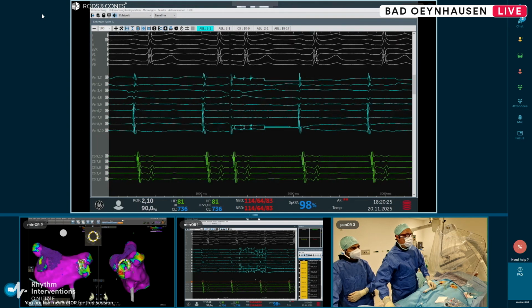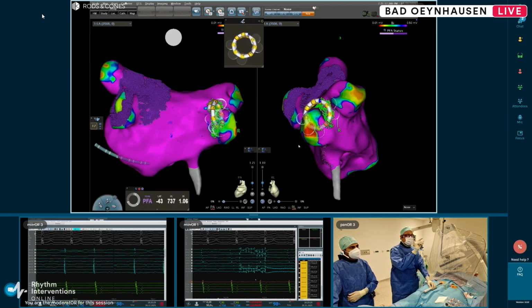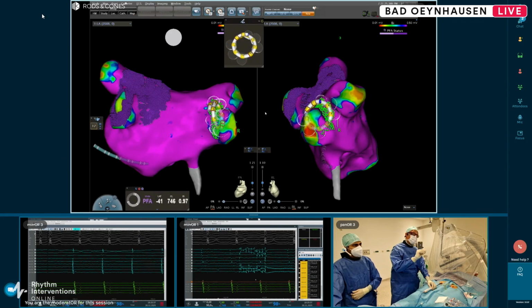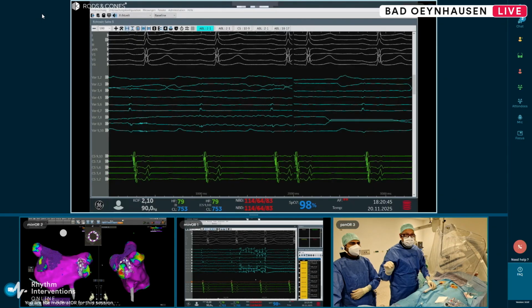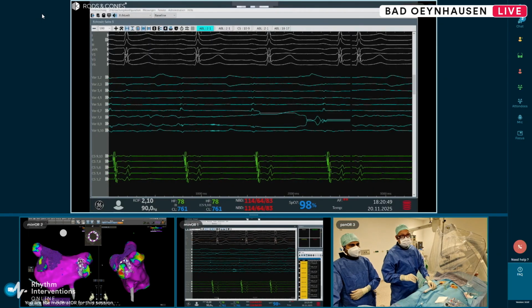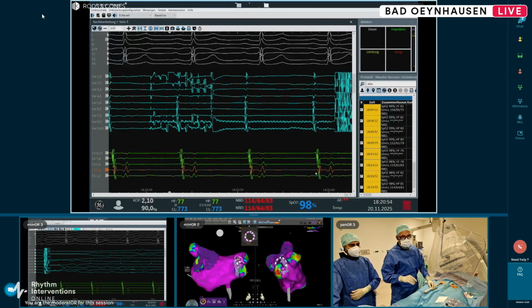We will try to ablate here, but you can already see now in the bullseye there is an overlap between electrode 1, 2, and 10. So let's see whether the system will allow us to ablate here, but it can be that it will stop and not ablate. We will see. And it works. So that's good for us, the patient. Please show us once again how the signals were eliminated, and therefore highlight the offline screen. Again, you can see loading.